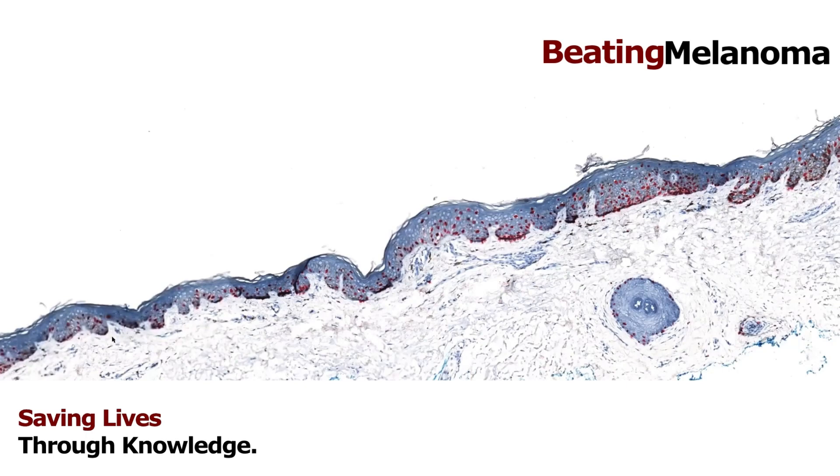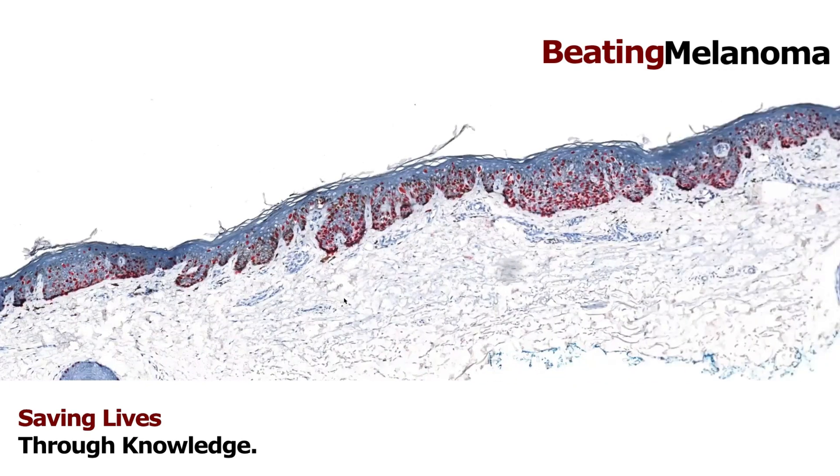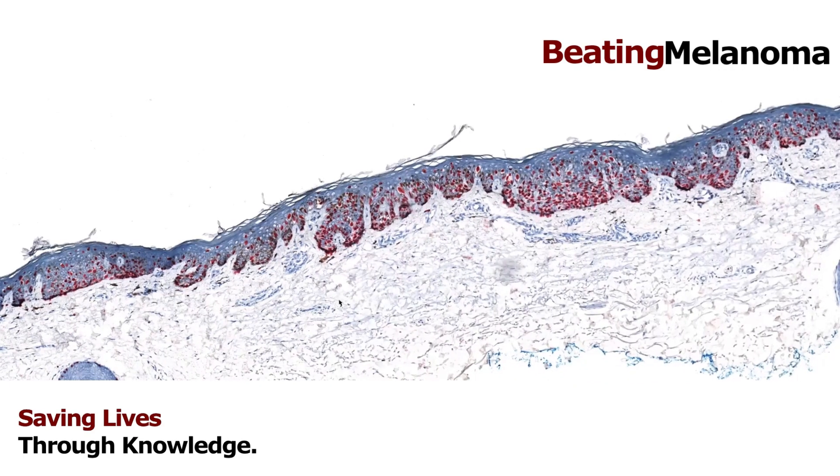Looking at the edges here, I could see the melanocytes didn't stop — they kept going and trickling out. This is a type of melanoma in situ that some people call lentigo maligna. It's a type of melanoma in situ that usually occurs in chronically sun-damaged skin, often on the head and neck, face, or scalp of older adults. It's called lentigo maligna because clinically, to the naked eye, it can look a little like a benign lentigo — those brown sunspots seen in older adults — but under the microscope it looks different.